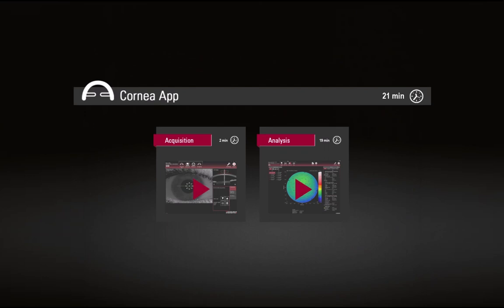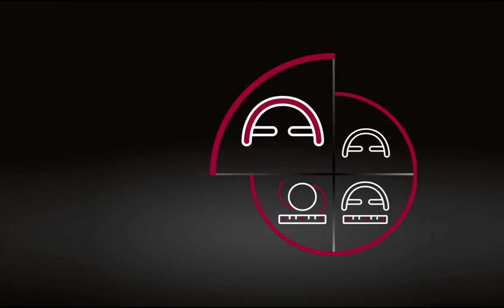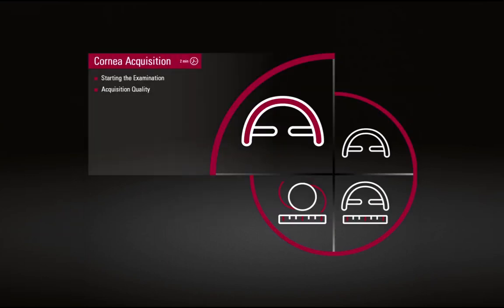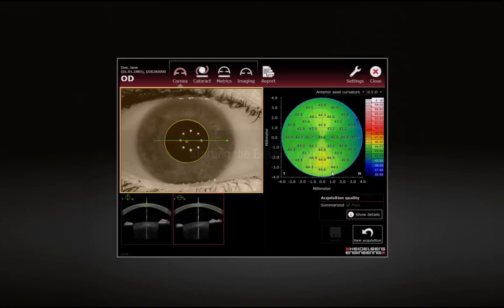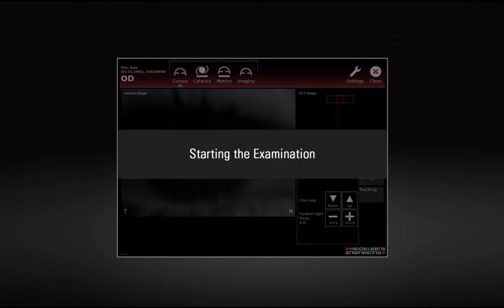Cornea App. Cornea Acquisition. Starting the examination.